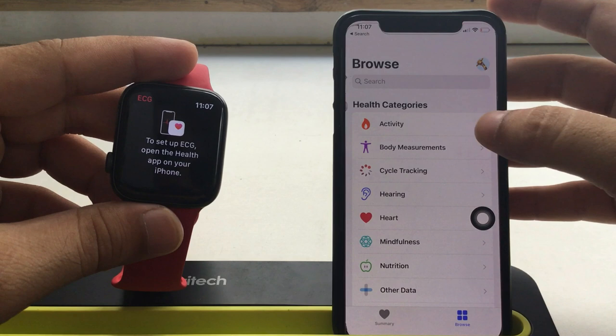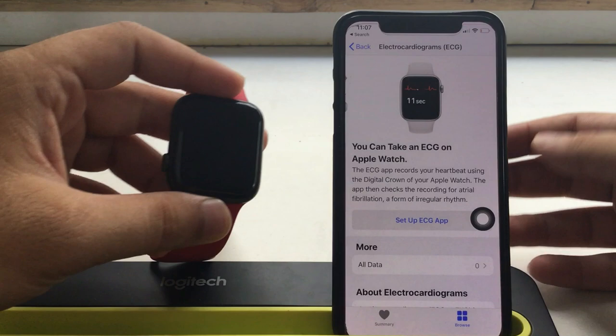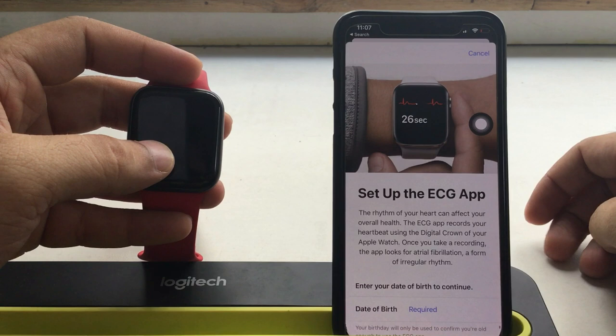Your iPhone will show general information about how to measure ECG using the Apple Watch digital crown button. You will see other options as well but they're not useful until you set up the first time. To move forward, tap on the setup ECG button on iPhone.